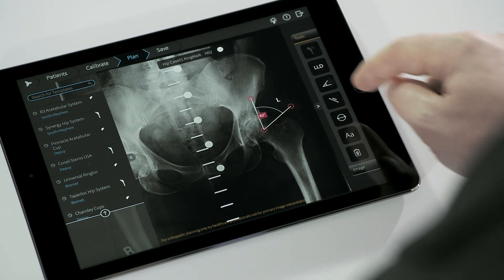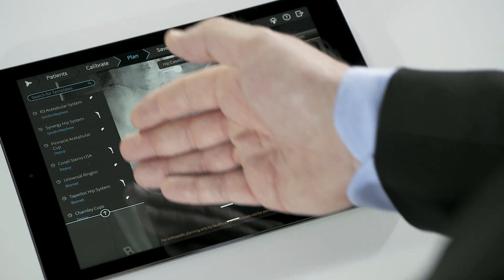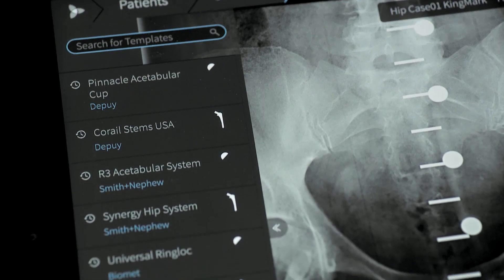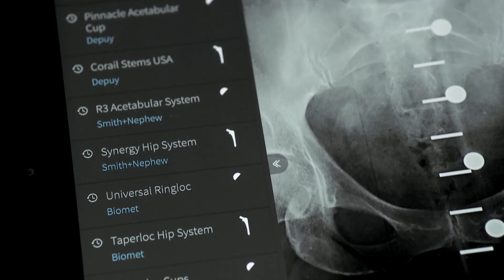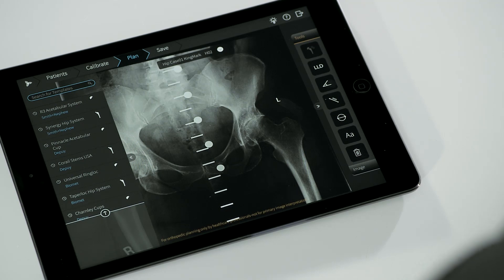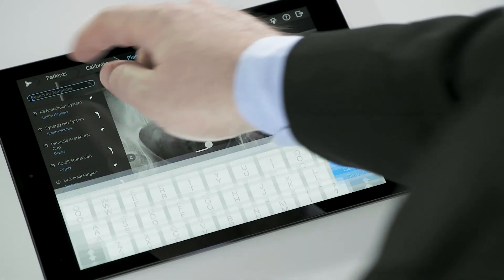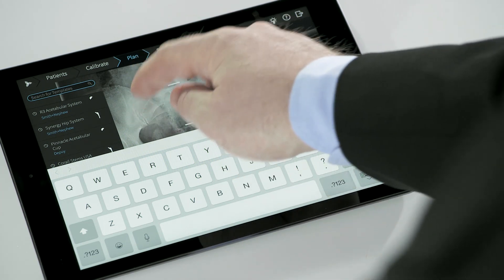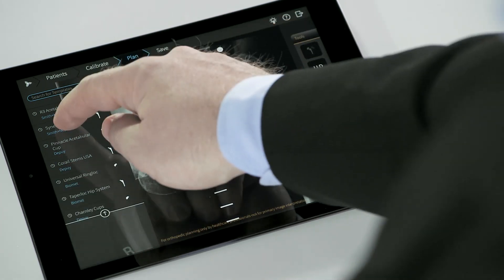On the left panel is an extensive, regularly updated template library, allowing for easy placement and adjustment of implants on the image. In order to locate an implant, search for it in the search box or select from the recently used list.